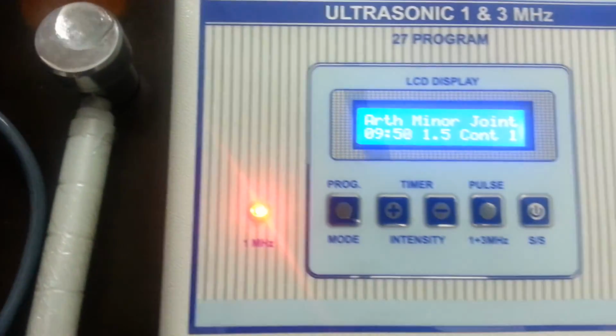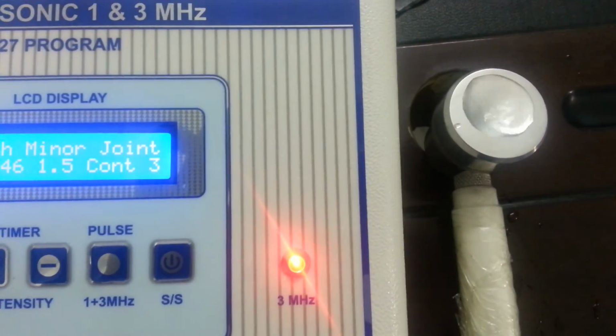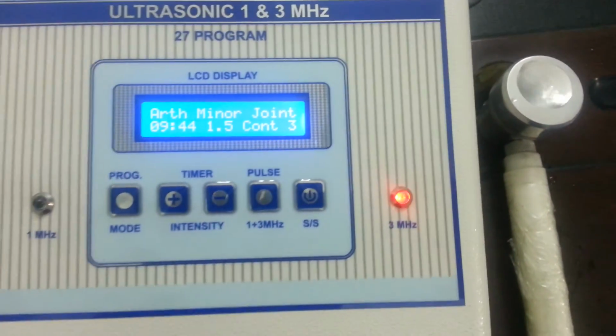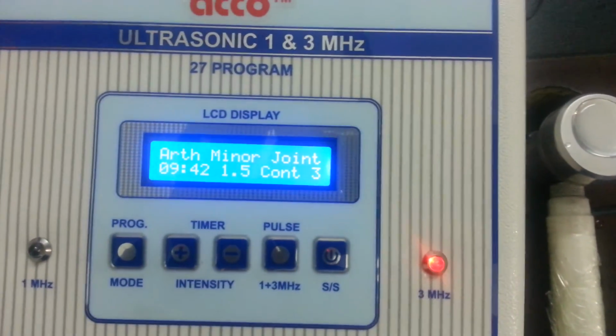You can shift the current from 1 MHz to 3 MHz. After treatment is completed, stop the machine. Switch off the machine. Demo is completed.